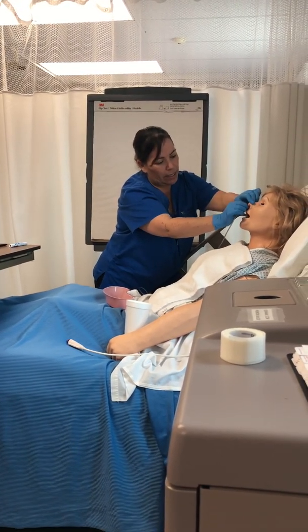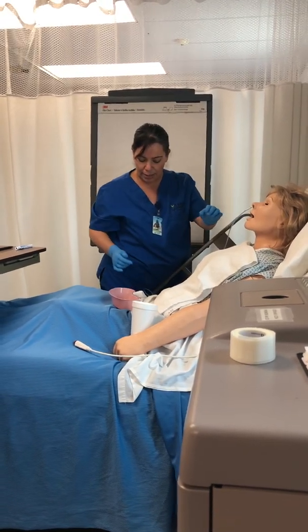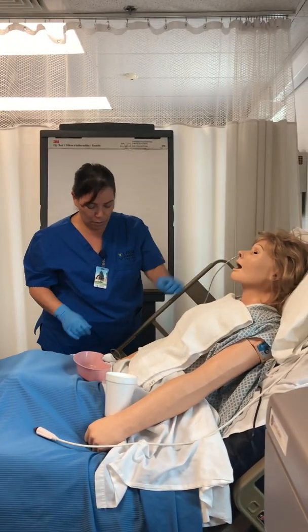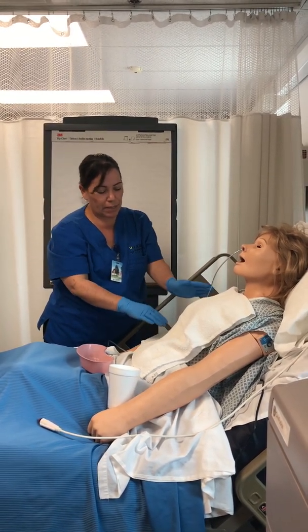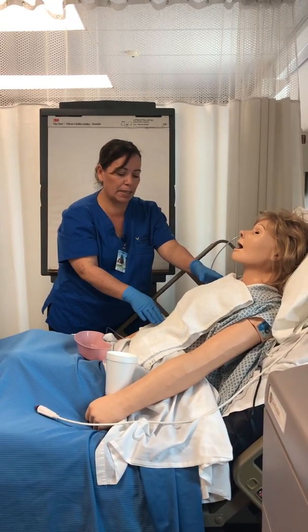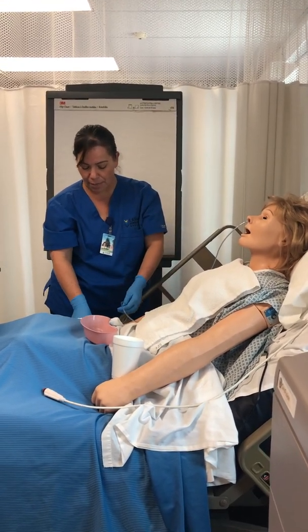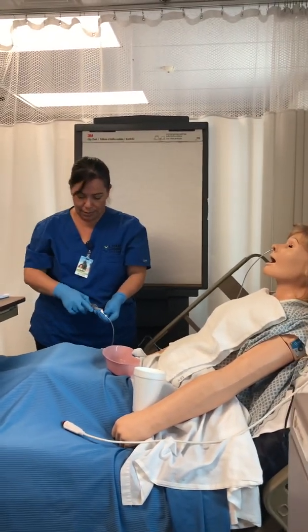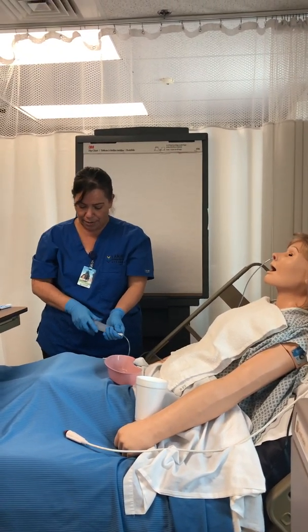And keep giving the patient water so he can swallow it while we're doing this, while he's relaxed and mouth breathing. So then when you do that, you check the measurements are all in there, and you check that the NG tube is in placement by ordering x-rays. And now I'm gonna check the pH, and you aspirate the stomach contents to measure gastric pH.